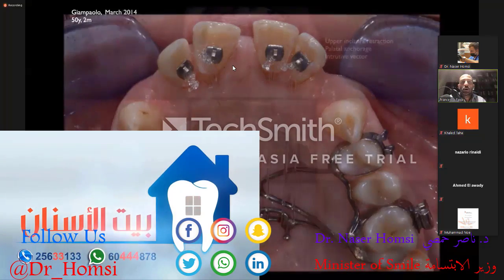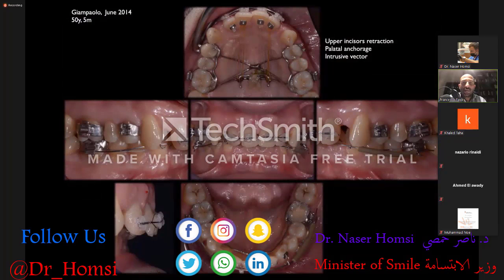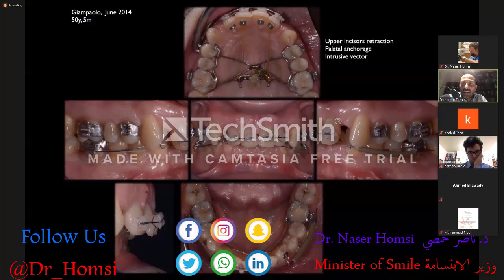So let's start to retrocline the upper incisors, and after a while teeth start retracting, and then we can go for alignment of the anterior segment, being careful not to lose the good spatial orientation as we've seen in the initial part of our meeting together. And we have the palatal anchorage that is retracting and intruding the upper incisors.